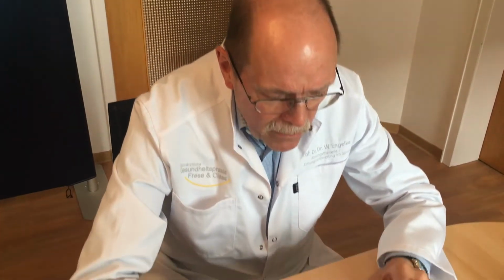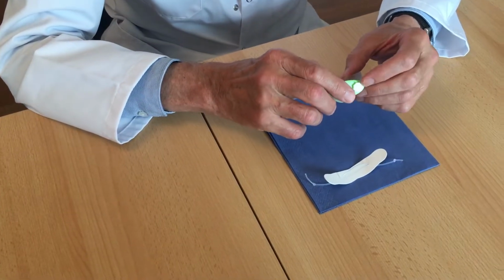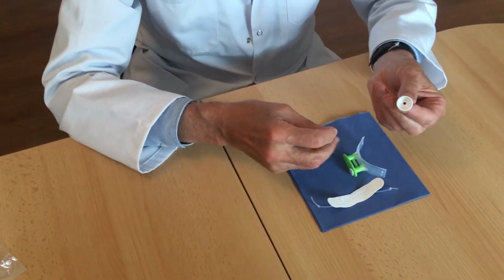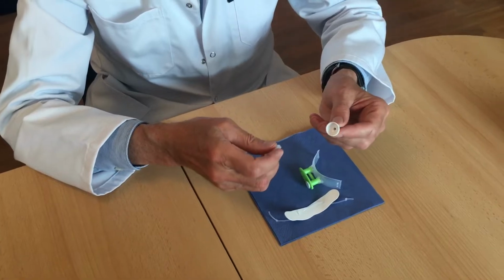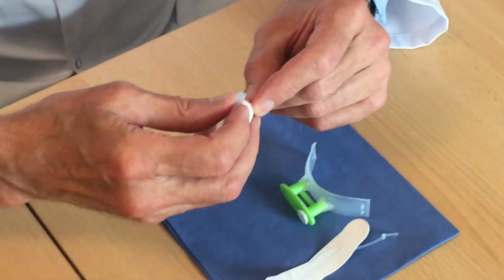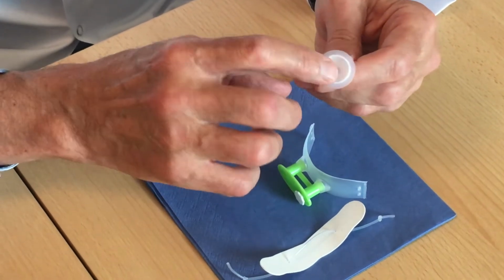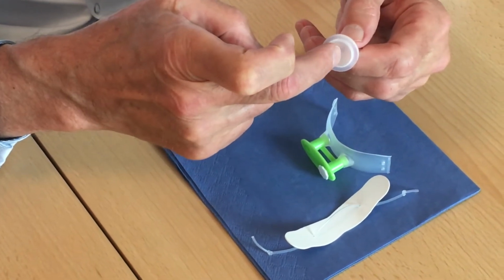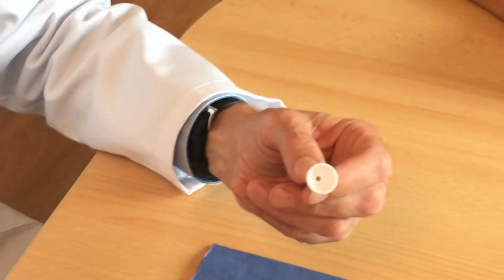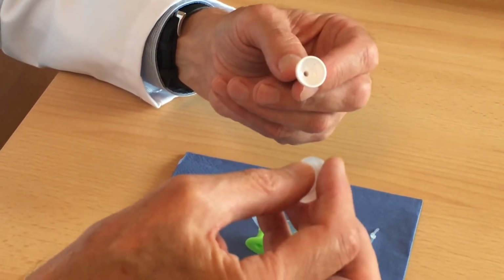Today we are going to demonstrate the use of the vacuum activator. The vacuum activator normally consists of a funnel together with a membrane. The membrane which is put on top of the funnel indicates if there is a negative pressure or a positive pressure. So the funnel is an instrument to indicate the intraoral pressure.